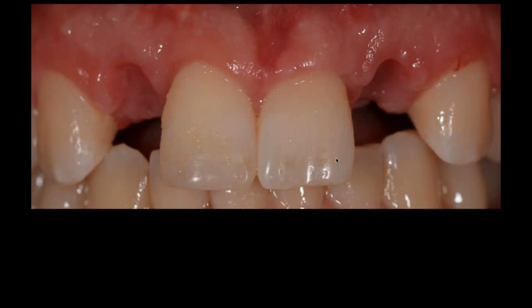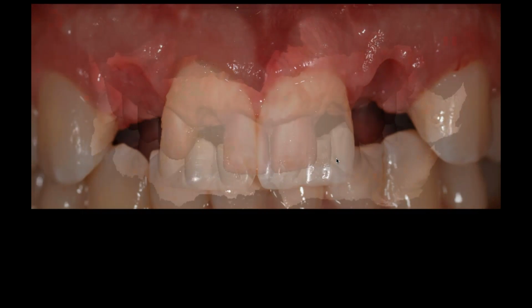And then when you do that over a period of time, which is going to take about 6 to 8 weeks, all of a sudden you got sulcus there. Now you can start thinking, oh, this is well shaped. And you can start planning. Now, so I image that.